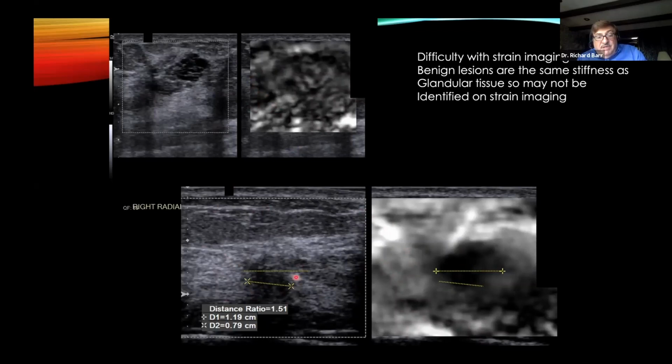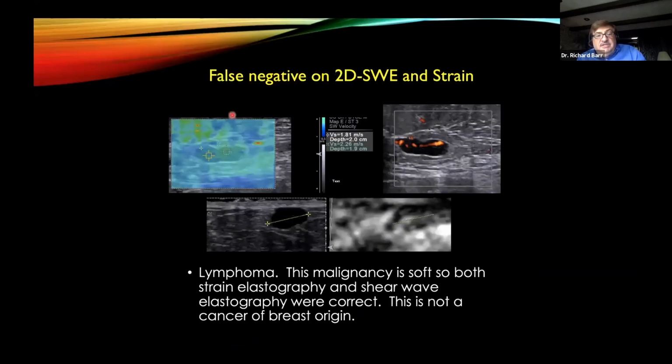This could have easily been a blue cancer on shear wave. So strain would have flagged to us, it's a cancer. Here, you don't have very much confidence because you don't see the lesion. This would have been very easy to have a shear wave image. You would not have any artifacts, it would be very simple. Again, this is our false negatives.